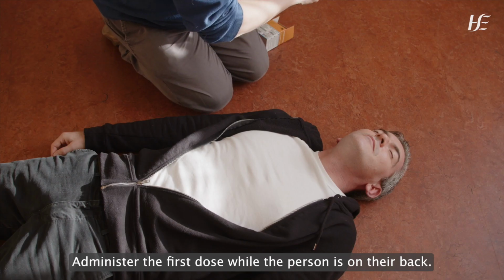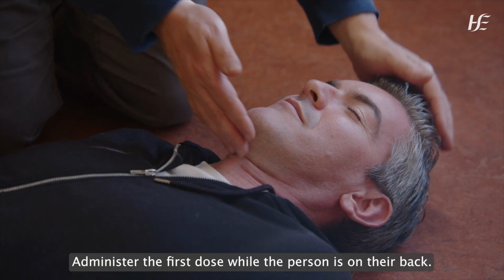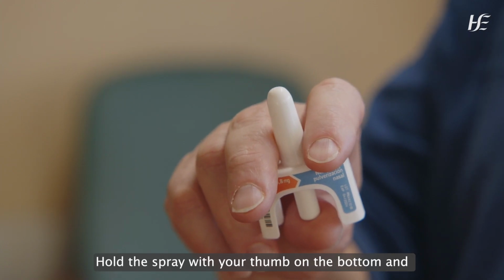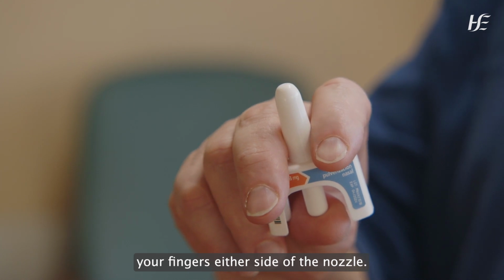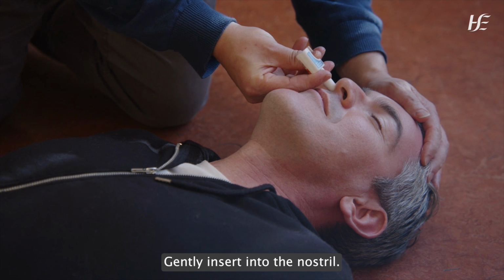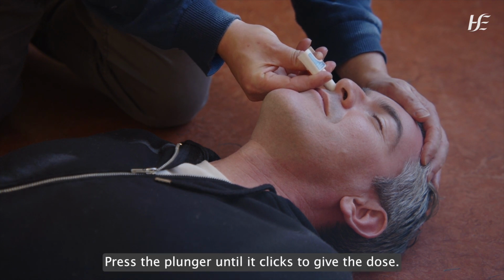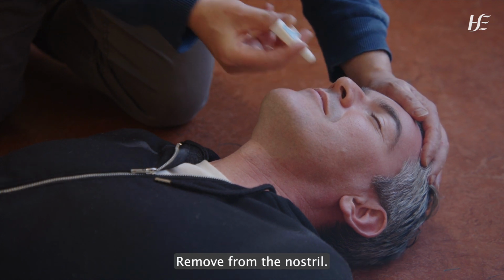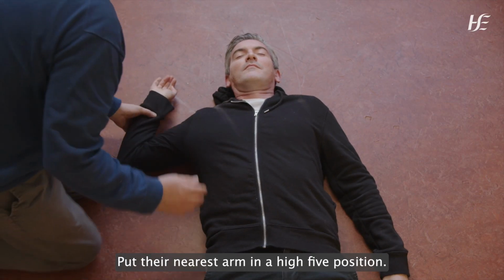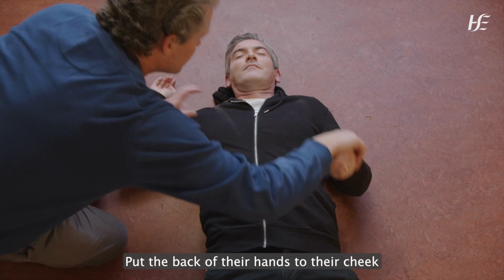Administer the first dose while the person is on their back. Tilt their head back. Hold the spray with your thumb on the bottom and your fingers either side of the nozzle. Gently insert into the nostril. Press the plunger until it clicks to give the dose. Remove from the nostril. Put their nearest arm in a high five position.